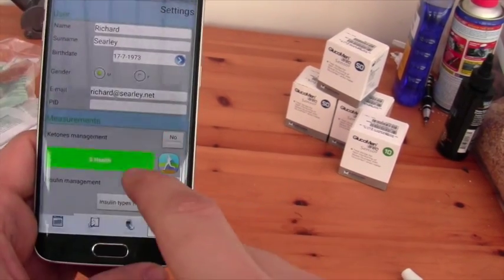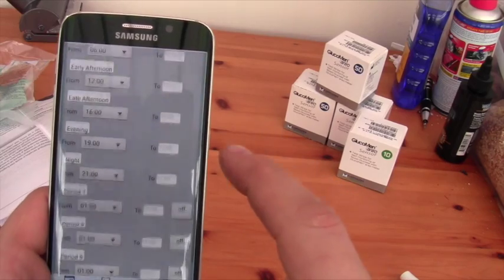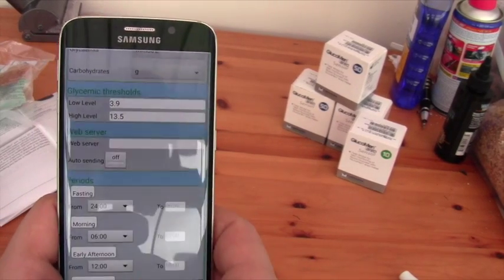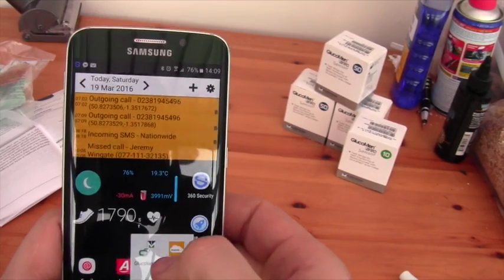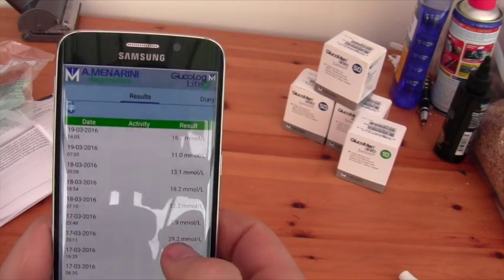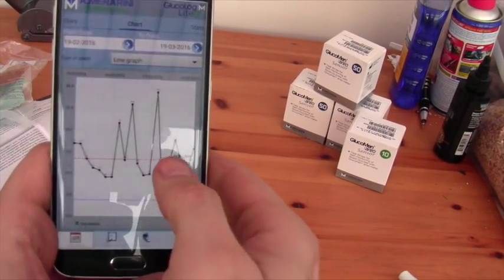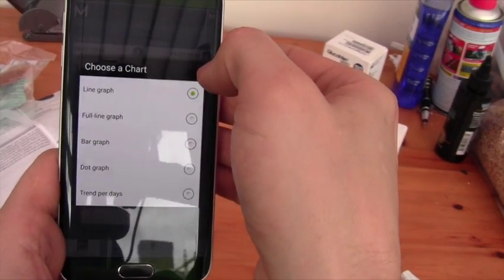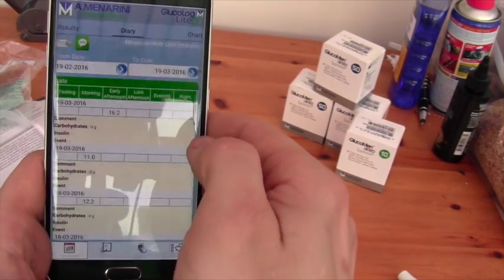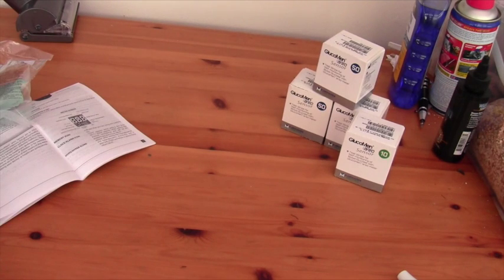This can be paired up to work with Samsung S Health if you wish. You can set different periods of the day — meal times, those sorts of things. Within the app itself you've got your diary, line graphs of your readings, changes to bar graphs, dot graphs if you wish. And from here you can also email the results by clicking that button. So that's all relatively nice and easy.